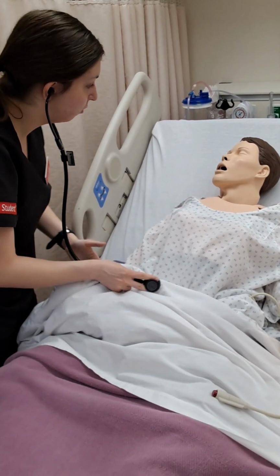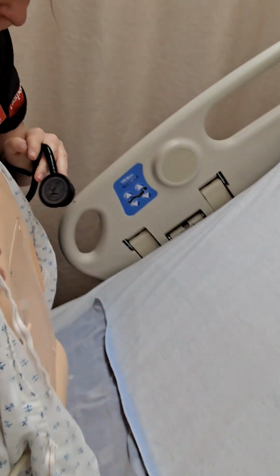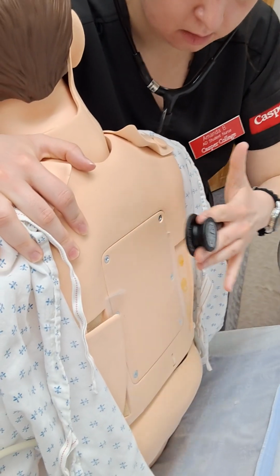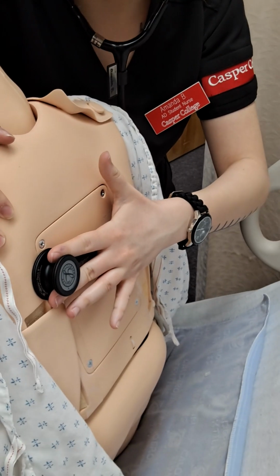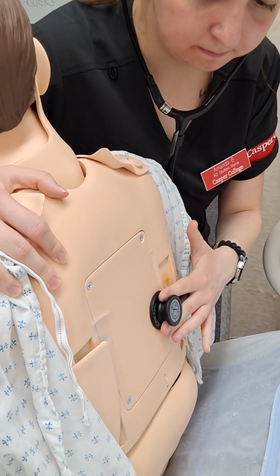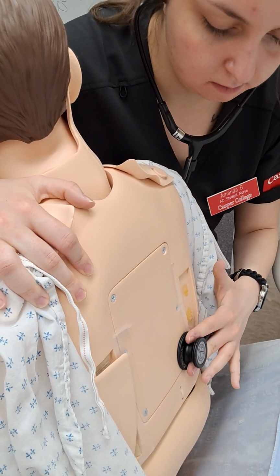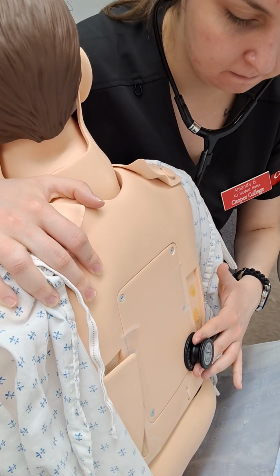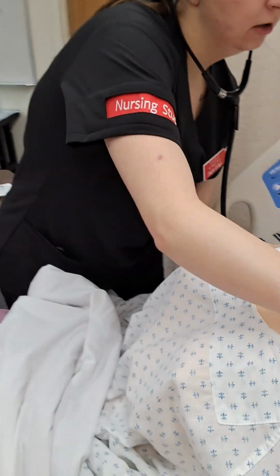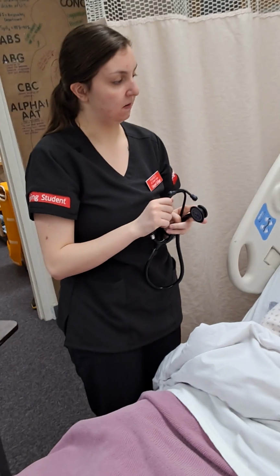Now I'm going to listen to your posterior lung sounds. I'm going to give you a boost. 1, 2, 3. Okay. Breathe in. Okay. So your lung sounds were clear bilaterally with equal chest rise and fall and symmetrical ventilations.